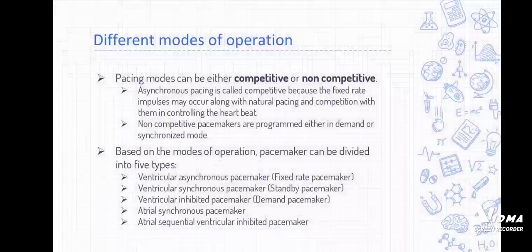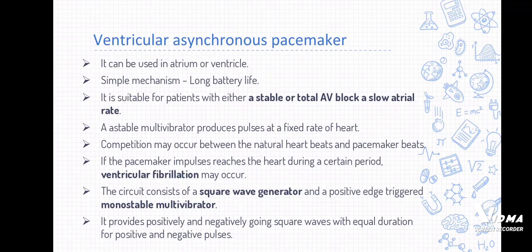Based on the modes of operation, pacemakers can be divided into types: ventricular asynchronous pacemaker or fixed rate pacemaker, ventricular synchronous pacemaker or standby pacemaker, ventricular inhibited pacemaker or demand pacemaker, atrial synchronous pacemaker, and atrial sequential ventricular inhibited pacemaker.